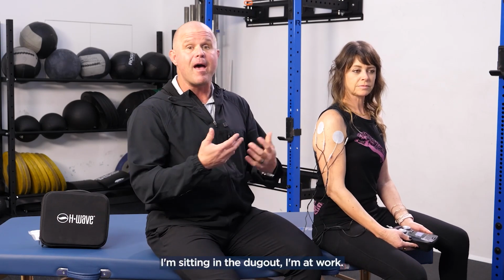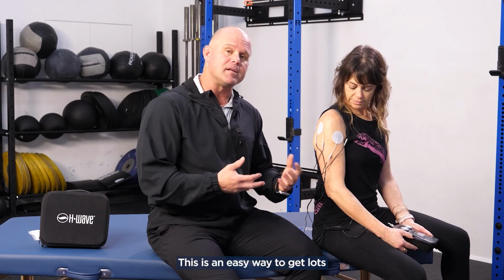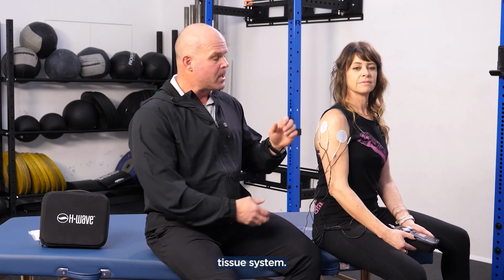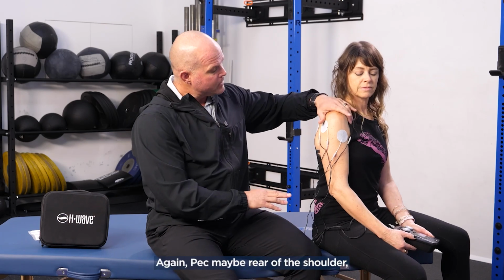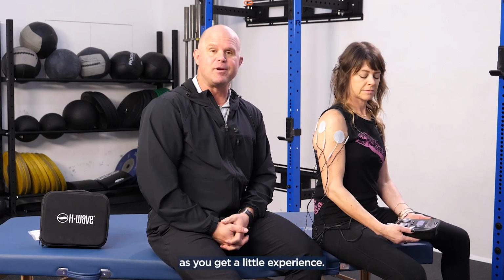I'm sitting in class, I'm sitting in the dugout, I'm at work, I'm at home watching TV. This is an easy way to get lots and lots of movement without motion so that we can have a healthier tissue system. So some ideas on pad placement again: pec, maybe rear of the shoulder, hit the triceps and biceps, but feel free to improvise as you get a little experience.